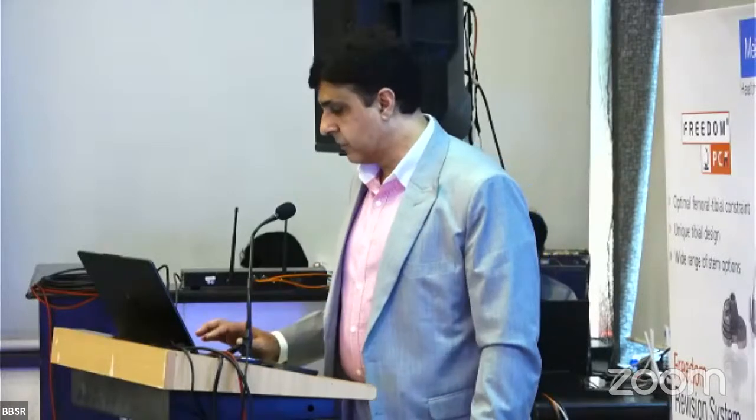So this was the axial patella. At that time, Zimmer had this patella available for the revision. You could sew it through, and it's an augmentation patella. And on top of it, you put a cemented implant. So for the patella, we managed her this way, and the revision for the knee was typical, using extensions on the tibia and the femur, distal blocks and augments. So this is one way to circumvent. The other way is, if the extensor apparatus is gone, you might require a rotating hinge to get across these cases.